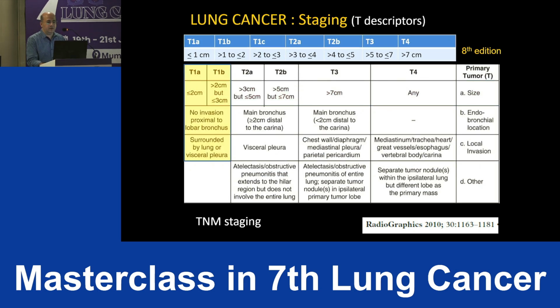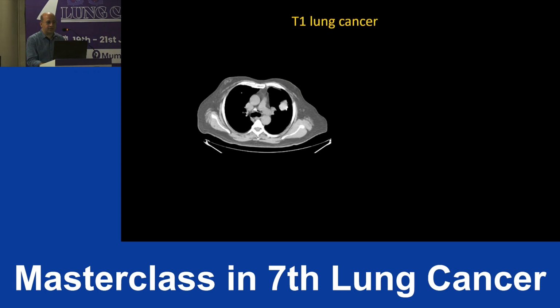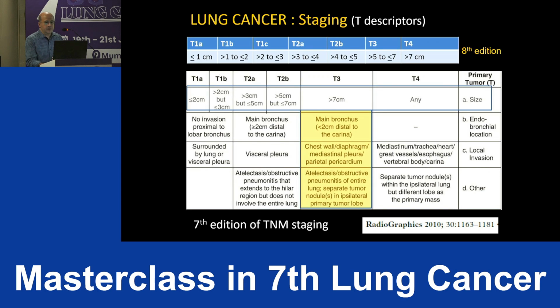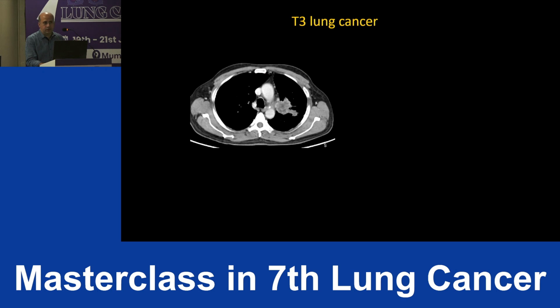If you look at T1, it's essentially a size-based criterion. This is a T1 lung cancer on CT scan. Do you need any other modality to upstage it? No. Even if you do a PET scan, it shows uptake, but FDG PET-CT does not add any additional value. T2 is the same as T1.